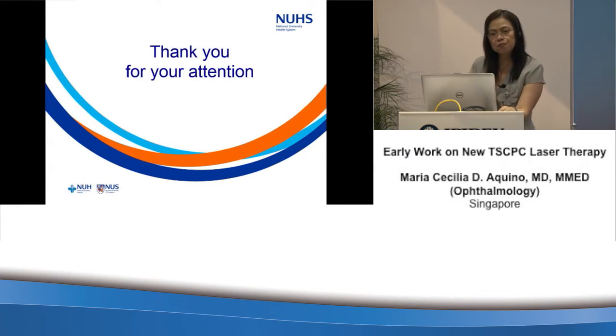In the series of micropulse treated subjects, the repeat treatment was done on the second month. But the interval, we have seen changes in the eye pressure. So the interval of repeat treatment, we had repeat treatment at the second month, that's the range, to 6 months and 12 months.